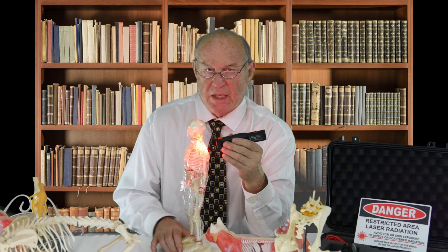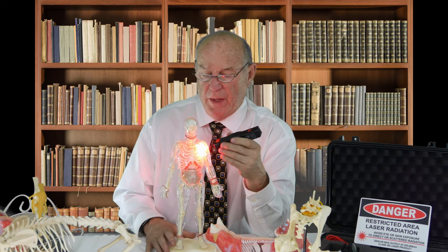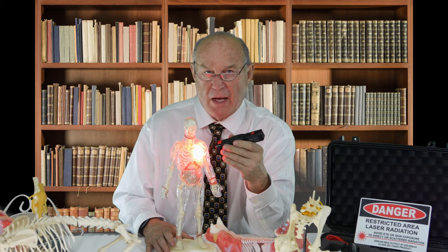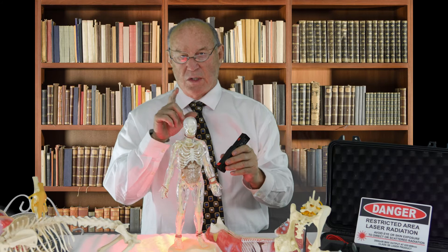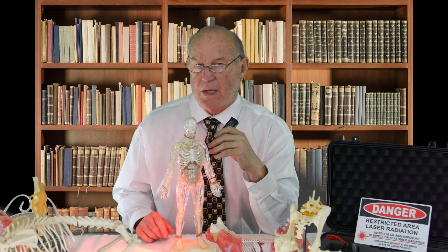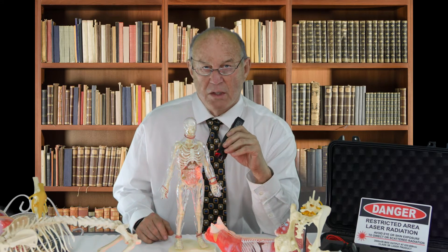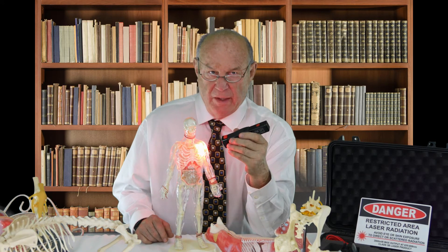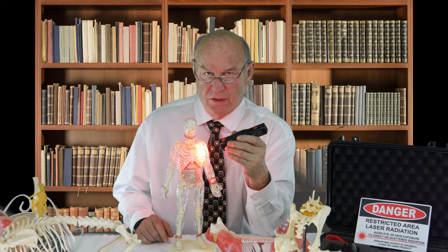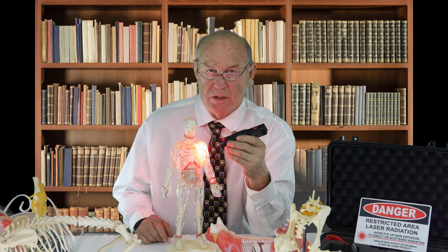Then, once we've spent 60 seconds with pain subset spinal, we switch it over to pain subset joint and go after the actual shoulder. Then we use the fracture subset nonunion fracture and laser the shoulder, and the success rate for this condition increases by at least 100 percent.